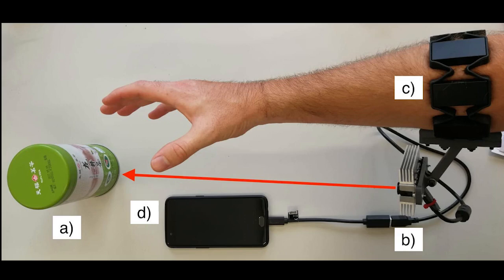Our system is shown here. The user will reach for the target object A with an RGBD video camera B observing the object and environment. The camera is attached to the user via an armband C and data is collected on the smartphone D. The data collected includes the grasp the user chose for this object.